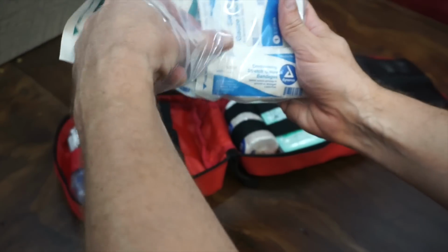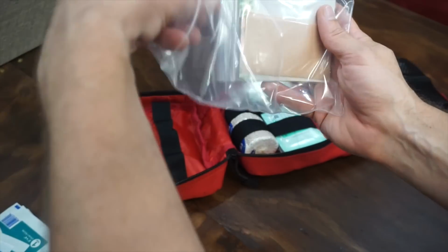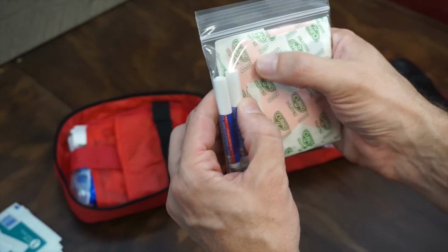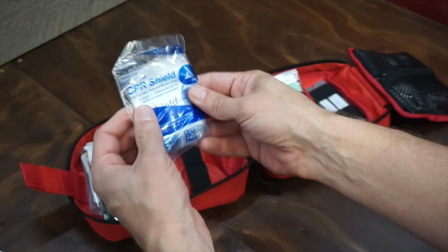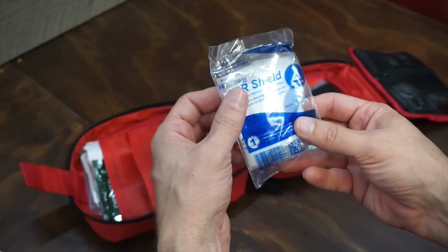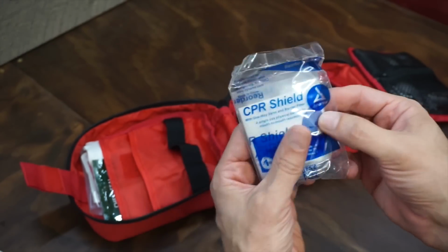There are a bunch of sterile pads and gauze. Looks like there's moleskin right there, there's liquid skin, and then some butterfly bandages and some standard bandages. A CPR shield. Funny story, my father was a police officer for about 35 years. Back in the early 80s, he did have to give CPR, and the dude threw up in his mouth. So, CPR shield.